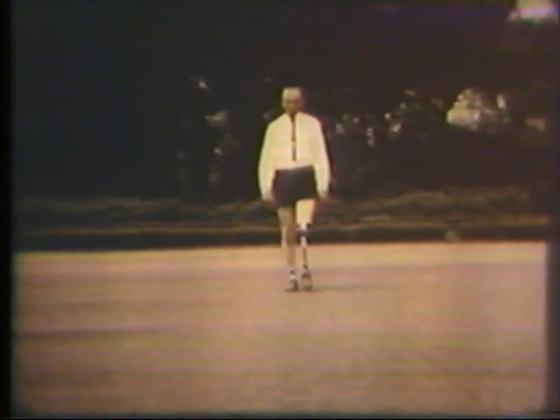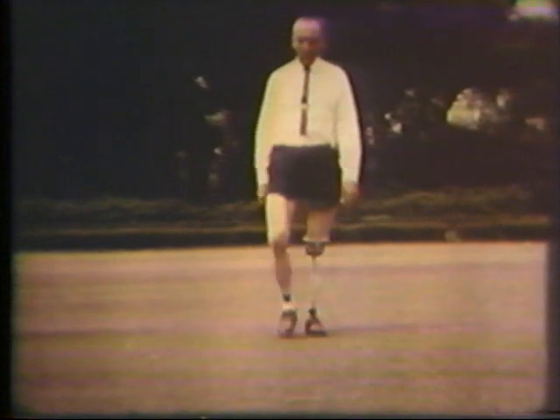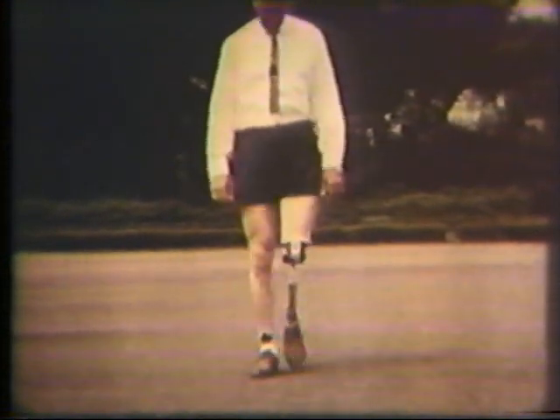One should attempt to analyze gait by observing each section of the limb separately, including the foot and ankle characteristics, the shin, the knee, the pelvis, and finally the trunk and arms. Either ascending or descending order is acceptable, but no attempt to view the limb as a whole should be made until its components have been studied individually.